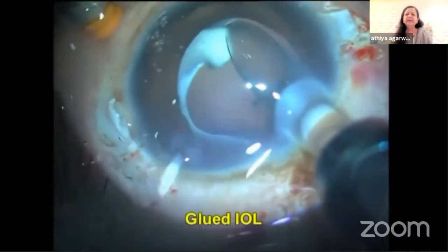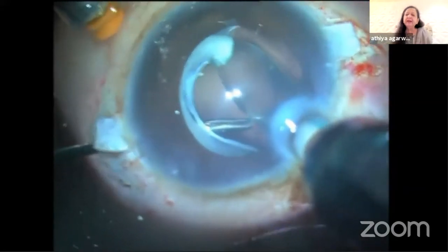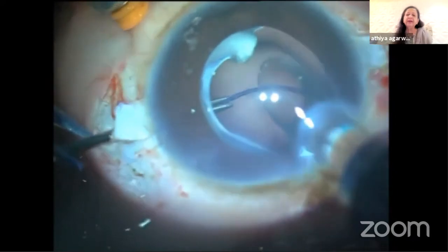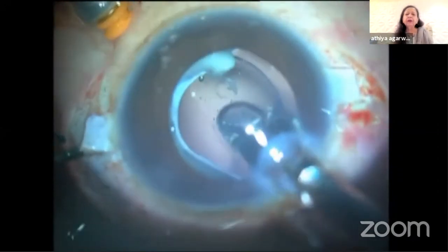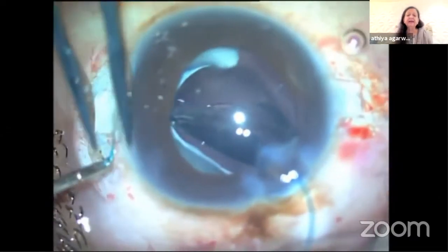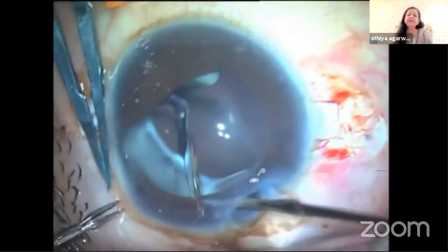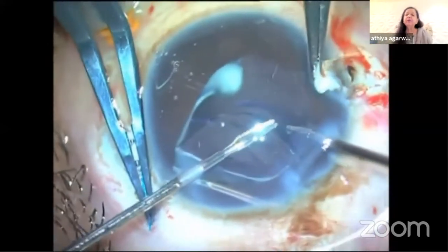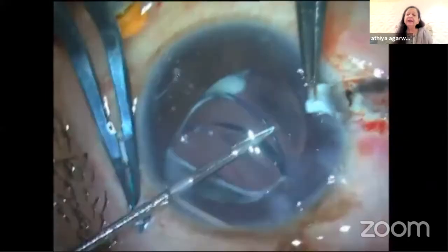You can see me here doing a glued IOL with the ring present there, using the MST forceps, through a 2.8 millimeter incision, a three-piece intraocular lens, holding on to the haptic tip, very important, the haptic tip, and externalizing the haptic through the sclerotomy, created 0.5 to 1 millimeter behind the limbus after creating a 22-gauge sclerotomy. You can see the 22-gauge sclerotomy on the right-hand side now.